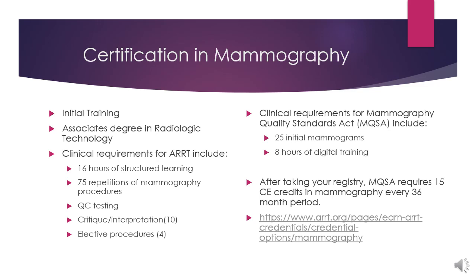And then the MQSA, which is the Mammography Quality Standards Act, also includes 25 additional mammograms performed after your training, and you must have 8 hours of digital training on the equipment at the facility that you're at.